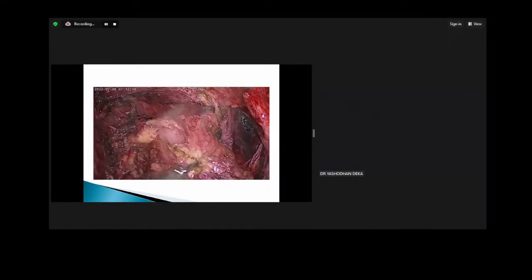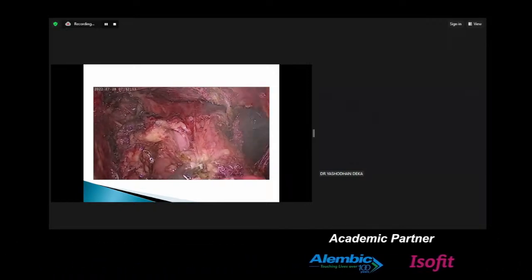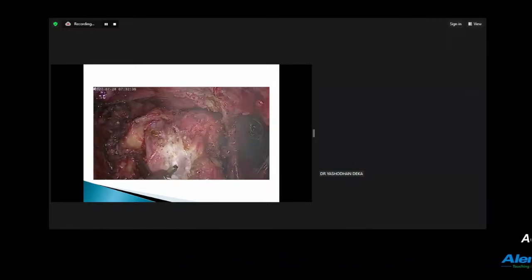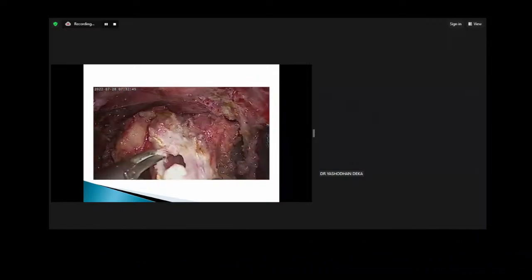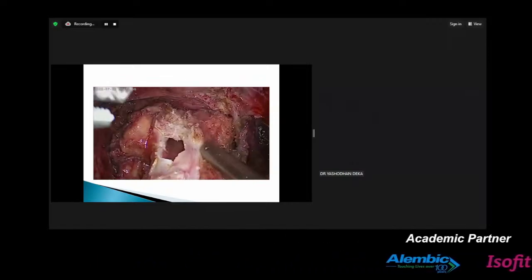So make sure the bowel preparation is correct, and then you just open the distal segment up. Once you open the distal segment, I will show the steps in a very crisp manner. Make sure there's a suction there, because if there's stool, then you have to suction it out. But look at this, the bowel preparation is excellent.